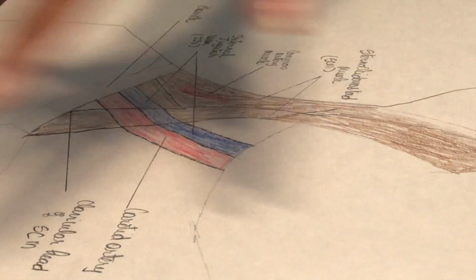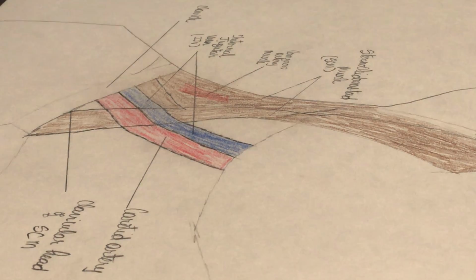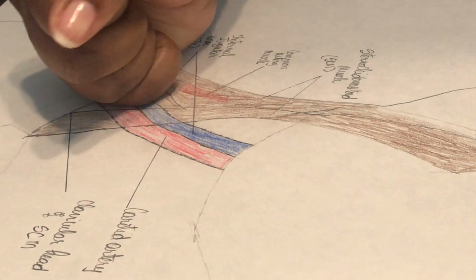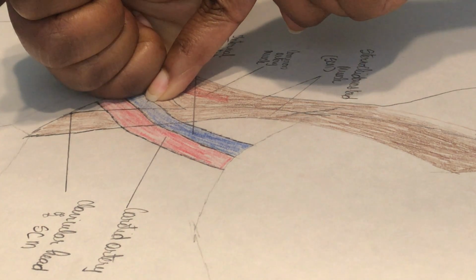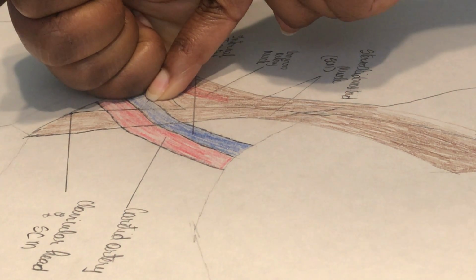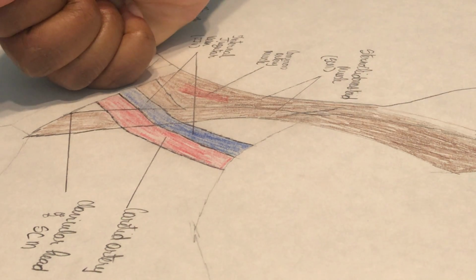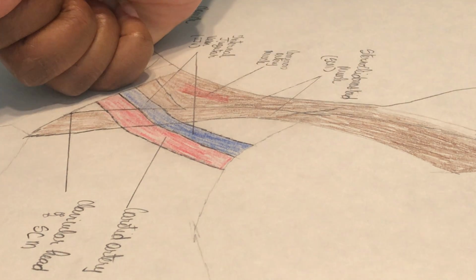So now we make sure that the field is sterile, and then we can start the procedure. This is the ultrasound. We inject the patient with 1% lidocaine in the surrounding tissue, and we wait 3 to 5 minutes to make sure that the area is numb.